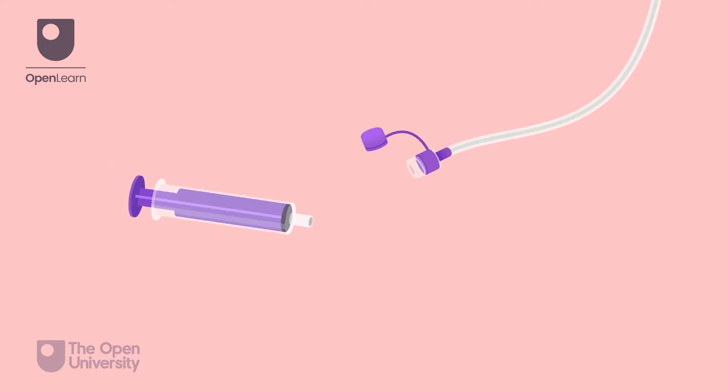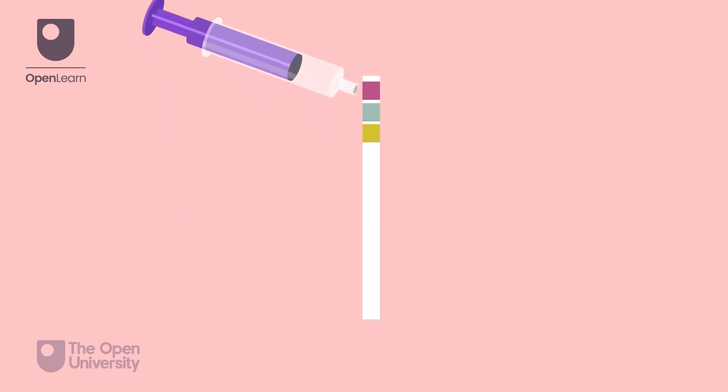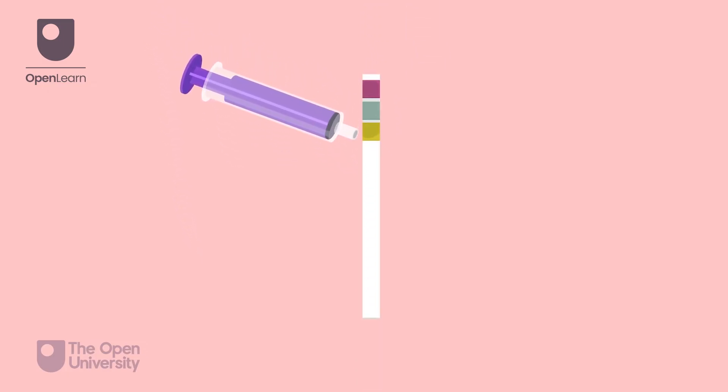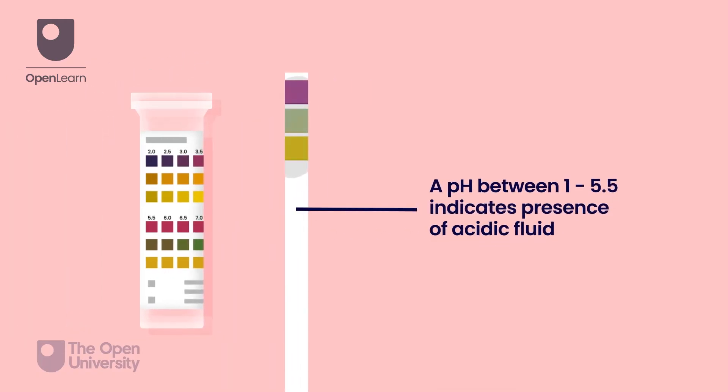Attach the syringe to the port and aspirate 1 millilitre of fluid. Drop the aspirate onto the pH strip as per your local policy. A pH between 1 to 5.5 indicates the presence of acidic fluid and is accepted in some trusts as indicative of successful placement of the tube into the stomach.